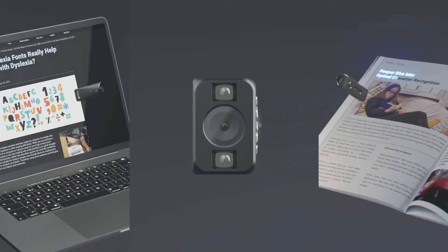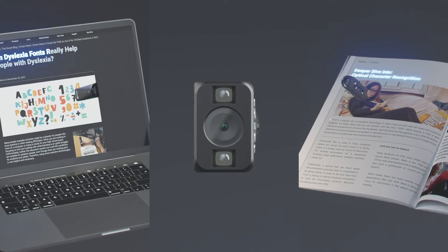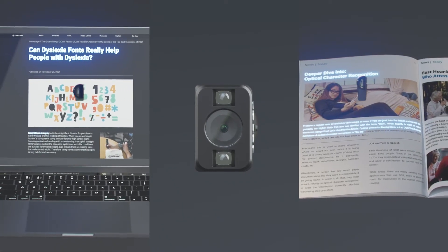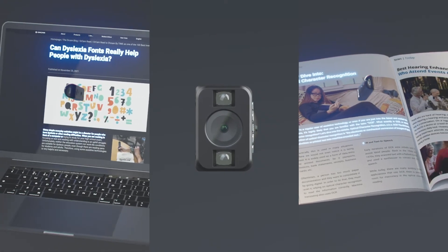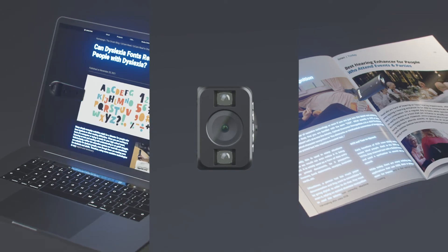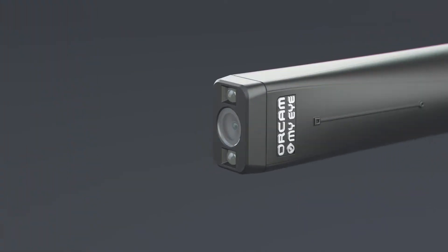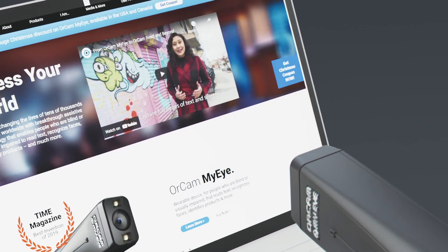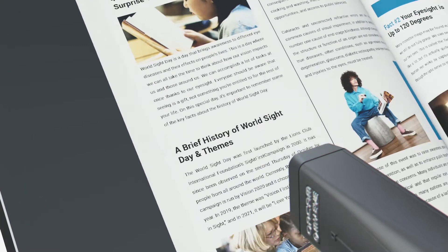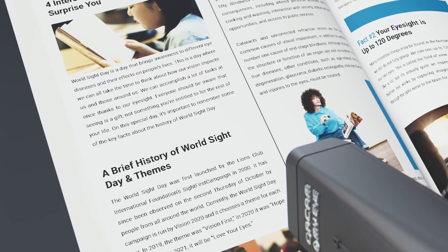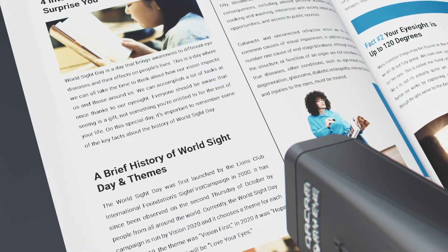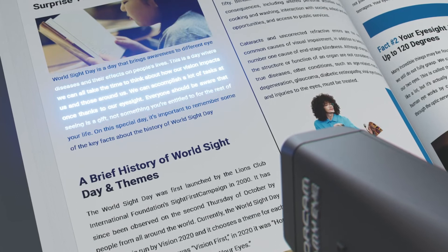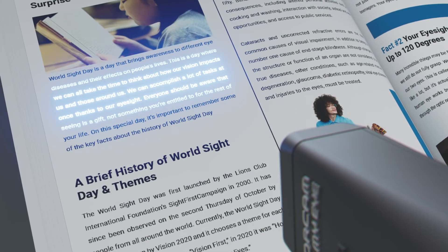OrCam MyEye's versatile set of features help increase independence at school, home, and throughout daily life. Instantly read the text that you want from any kind of printed or digital surface such as a book or computer screen. Interactive smart reading helps you pinpoint specific text.